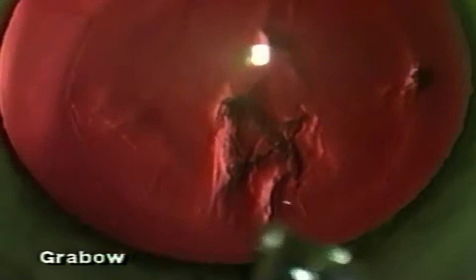I also try to make the capsulorexis a little larger than I used to, attempting to make the rexis now about five millimeters to cover a six millimeter optic IOL.